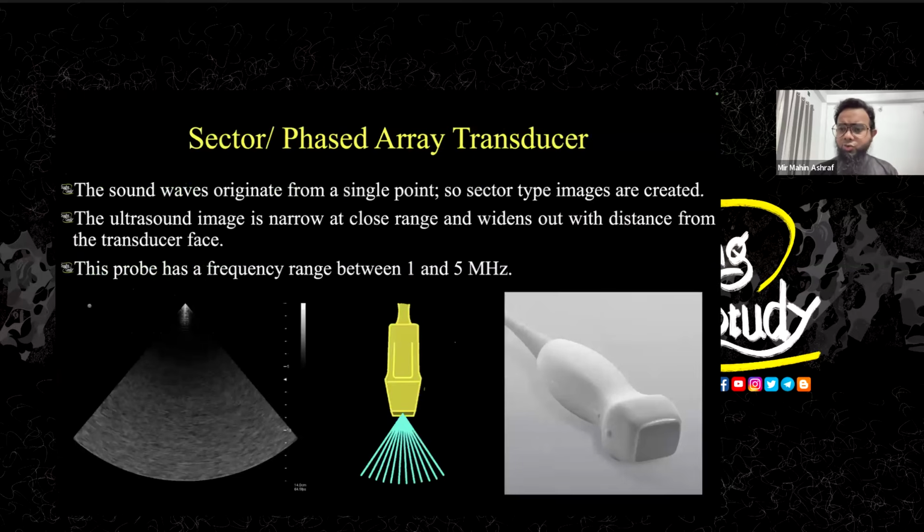Now come to the transducers, the most valuable types of transducers. There are many in different price ranges. If you look at a single transducer, like this one, the sector or phased array transducer, it has many varieties from many different manufacturers. So when you are getting one, you should be careful about the frequency range of that transducer and what you need. Usually the machine seller will describe their different transducers to you before you buy.